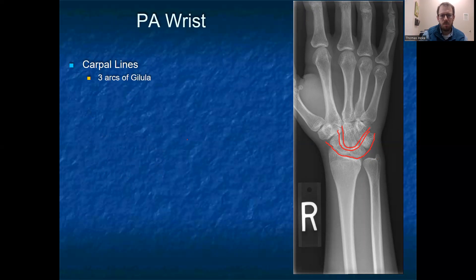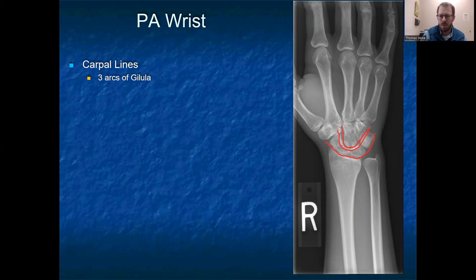One more thing to look at on the PA of the wrist are the three carpal lines, or the three arcs of Gilula. The first arc is the most proximal row — the scaphoid, lunate, and triquetrum. Distally, you should see a concavity of these same three bones. Any disruption suggests dislocations, fractures, or anatomic variations. The third or most distal arc is the capitate and the hamate.